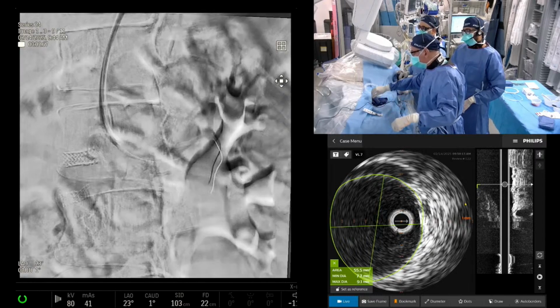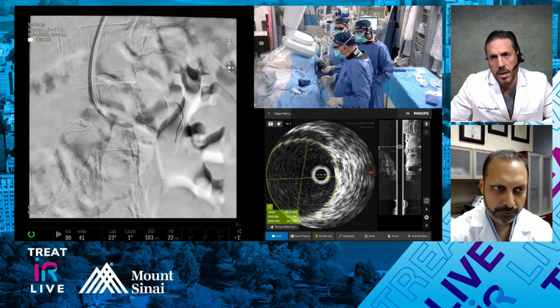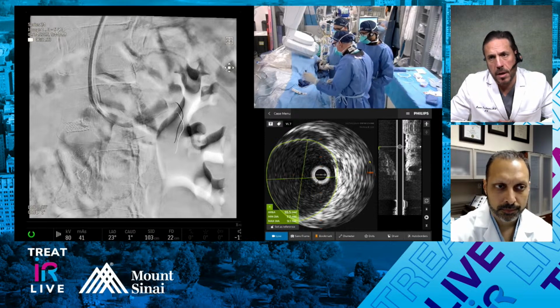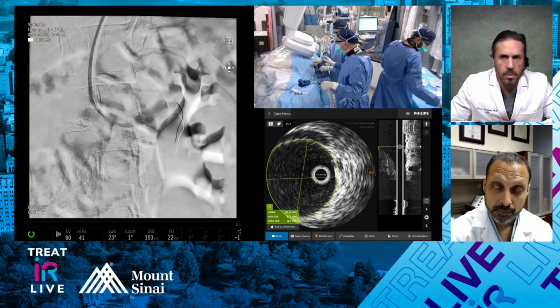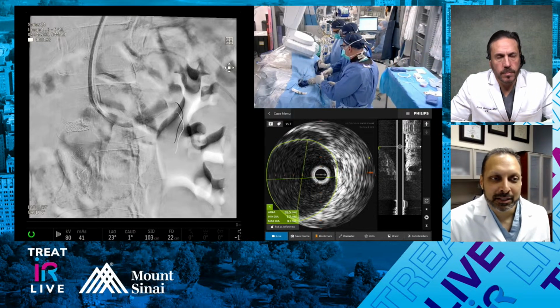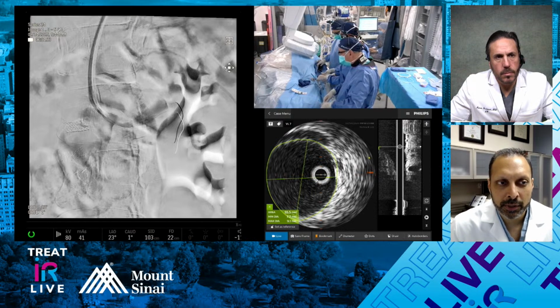I mean, this is just sort of a theoretical question, and maybe Parag has an insight on it. If you're deciding between, let's say, a 7.15 and a 7.18, do you think that there's a difference there? Because there's really not a branch vessel that we're concerned about in the renal artery here. Do you think it increases the likelihood that you're going to get some sort of longer segment in-stent restenosis, or it just probably doesn't matter that much? Not really. It's 3 millimeters, but what I like about the 18 is there's a chance you're going to want to overdilate this potentially, even with the same nominal balloon, more than you did before. And if you had to go back in, to Rahul's point, you can anticipate a little bit of foreshortening.